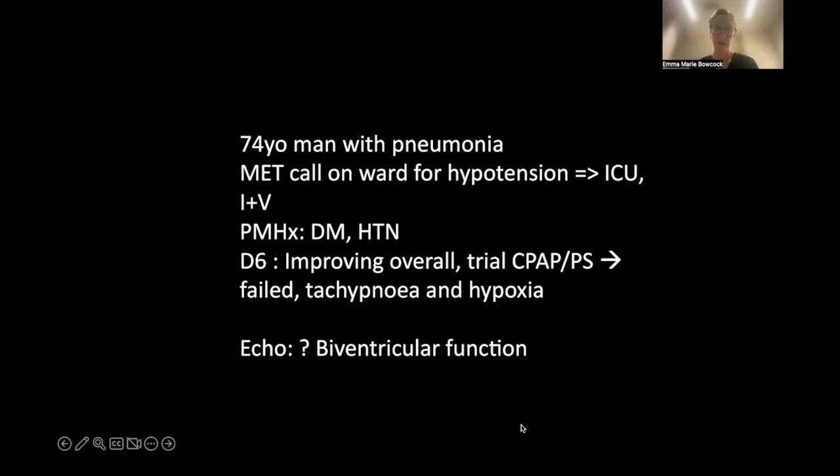So a 74-year-old man with pneumonia, met call on the ward for hypotension, comes to ICU, intubated, ventilated, past history of diabetes, hypertension, day 6 improving overall, trial of CPAP, pressure support failed, tachypnea, hypoxia, echo to look for biventricular function.